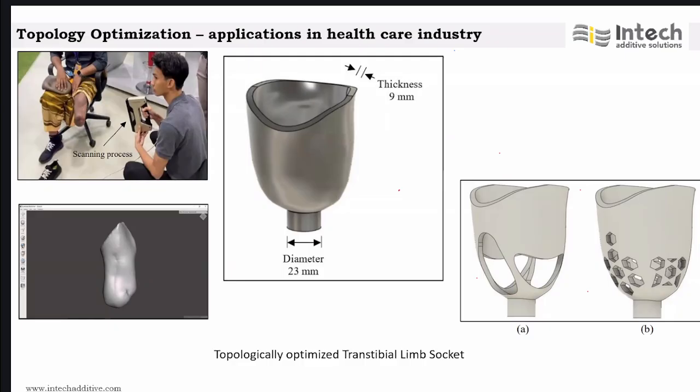It requires a lot of post processing. So my takeaway is, I would say you have to go for the laser based powder bed fusion process. But I've seen a lot of people doing titanium implants in EBM, but it involves a lot of post processing. It's not like LPBF. LPBF is a straightforward thing. So it has got so many advantages over EBM.